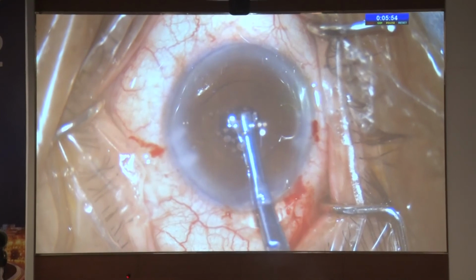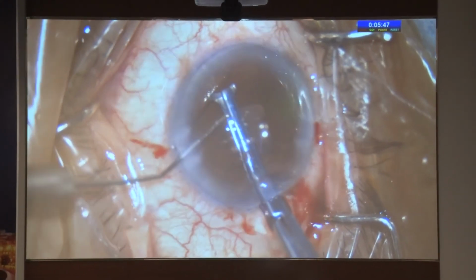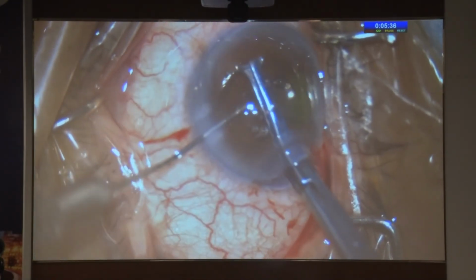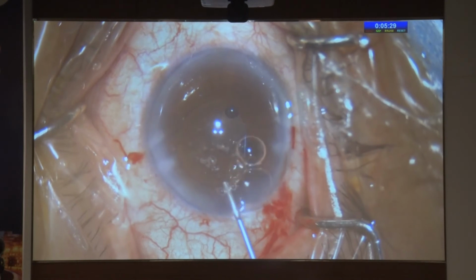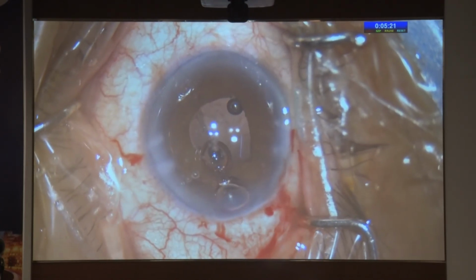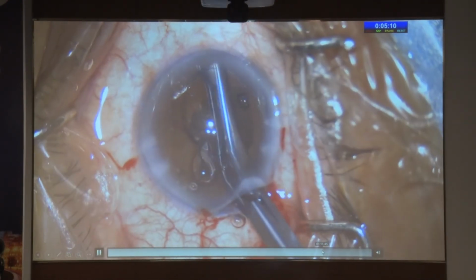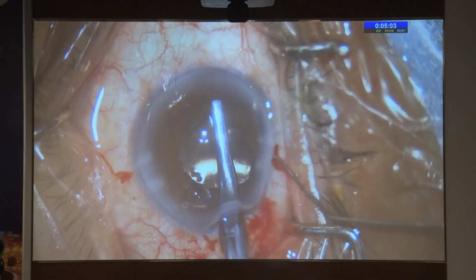First, the optic is being held and a spatula is passed from the opposite paracentesis to enclave the iris. Once this has been done, you can safely leave the optic because it is being supported by the iris. There is a change of hands and the spatula can be passed from the other side. The second haptic is now being enclaved after pushing it under the iris.